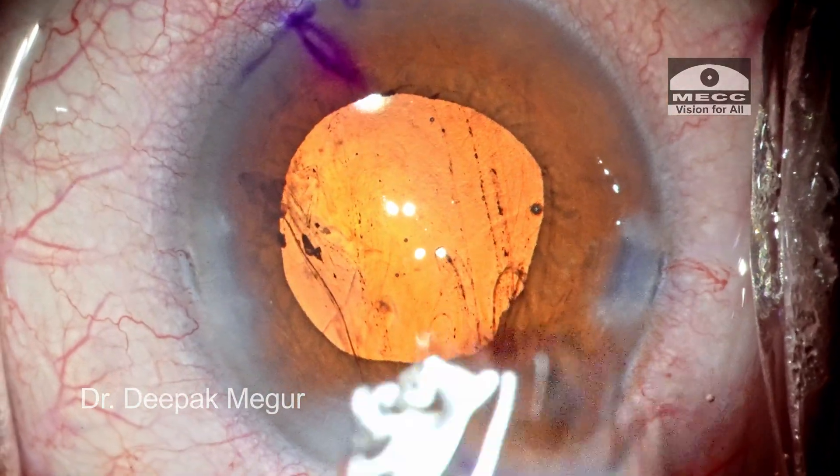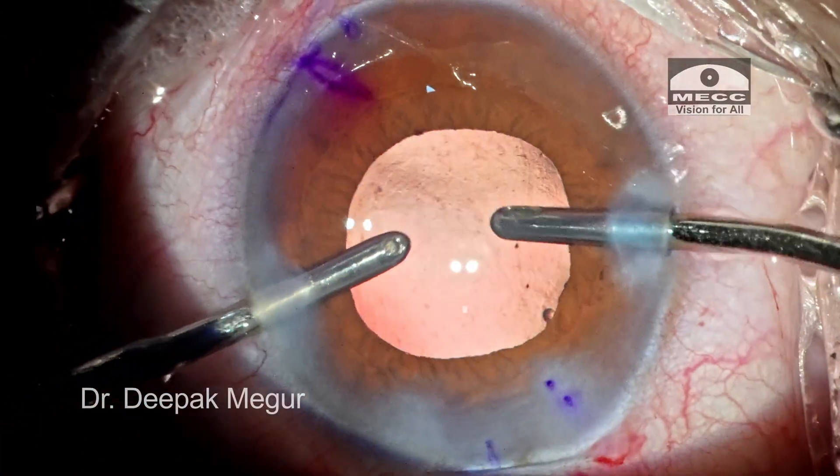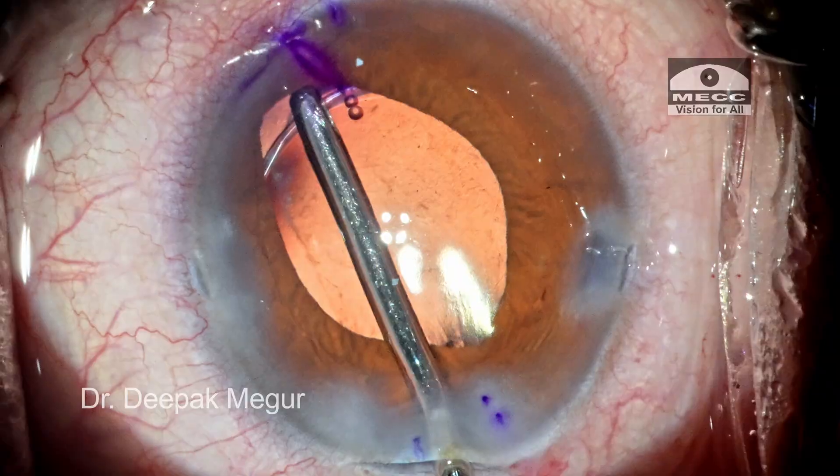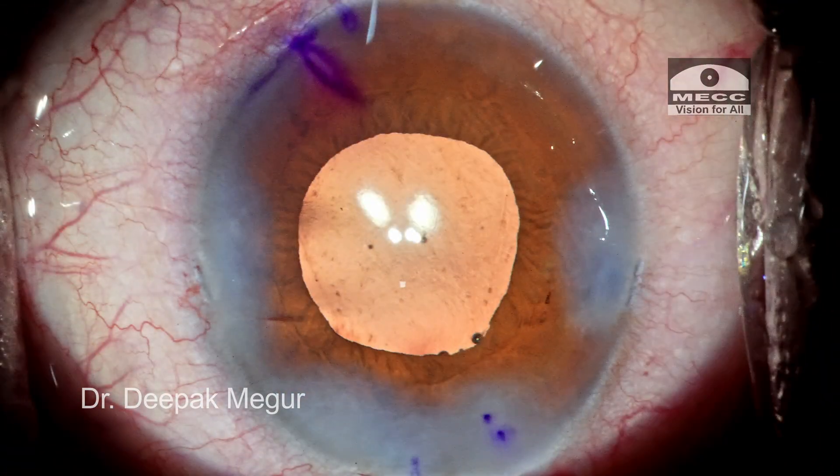The removal process is as easy as that of the B-hex. OVD behind and in front of the lens is removed. The toric lens is oriented to the desired axis. Time to close.